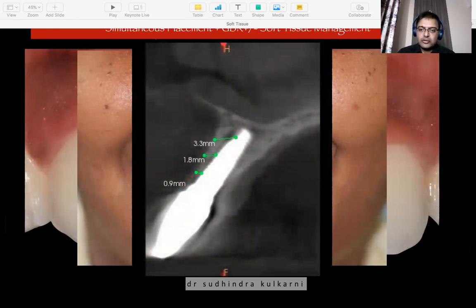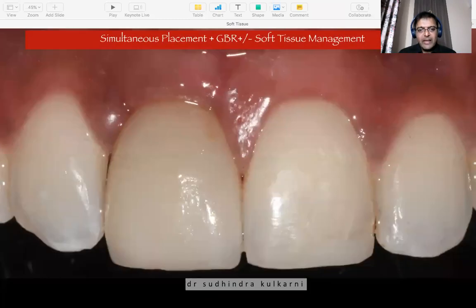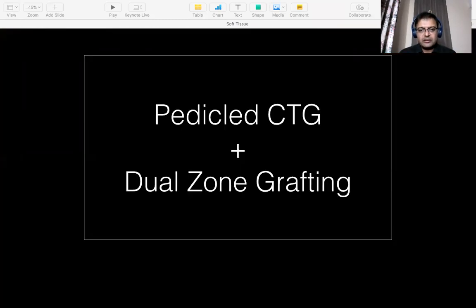So we did the connective tissue graft along with GBR in the same sitting. So it was implant placement, GBR, and connective tissue at the same time. And that's how she looks right now.